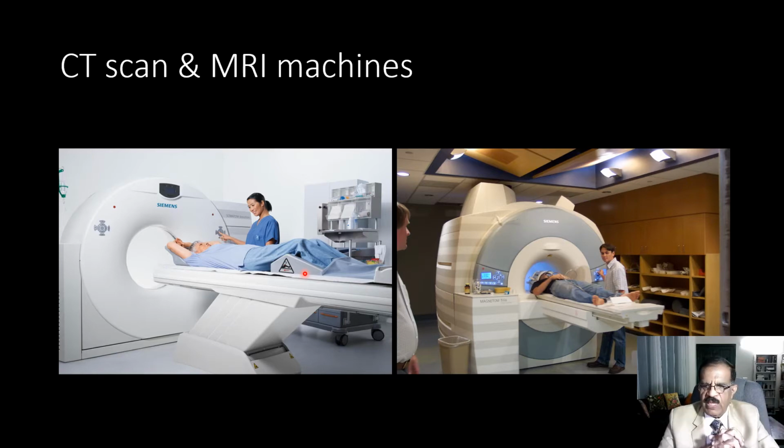I always say that you can get a much better opinion from the radiologist because they are experts in this field, but every internist must know the basics of imaging and must be able to read common CTs, common MRIs and common conditions which are diagnosed on CT.